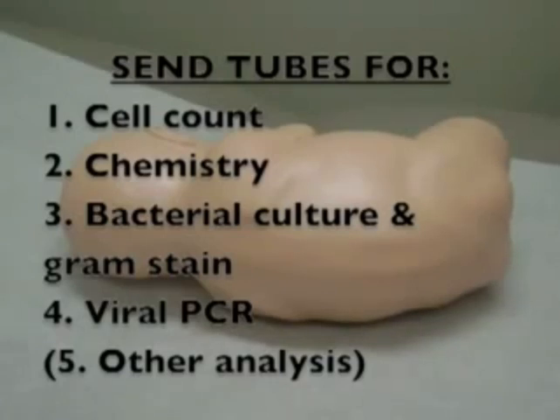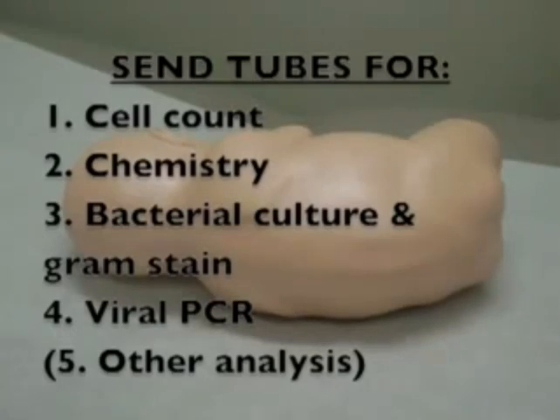If there is blood, you will need to decide whether it is blood or bloody CSF. If it is blood, take the needle out and try again. Bloody CSF, however, is not as dark and it will not clot. Eventually, it should run clear. In the case of bloody CSF, use the last collected tube for cell counts to minimize the effect of the blood.